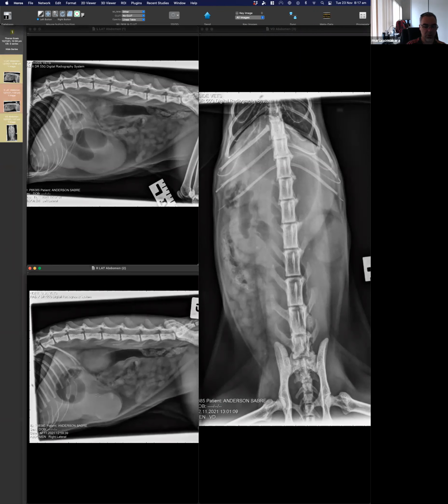And if we come back to the other projection, now this is the pylorus, and there are these wavy contours that I think are peristaltic waves. And I think it makes sense in this case. So now this is all fully fluid filled, and then the gas is now here, where the fundus is. So additionally, it looked abnormal, is in the position of the stomach, is gas and fluid filled, and not only that, is behaving as an anatomical structure that has a component on the left and a component on the right, and the fluid and gas is moving accordingly. So super strong evidence. Makes sense?